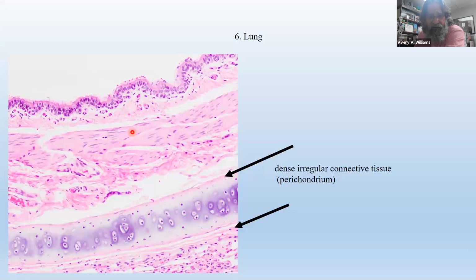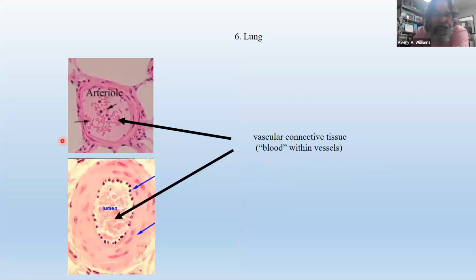I don't know if you recognize this up here. There's tissue everywhere. You should recognize this stuff. Maybe I pointed it out, but that's smooth muscle up there. I didn't point it out, but there it is. But I think I already pointed it out somewhere else.